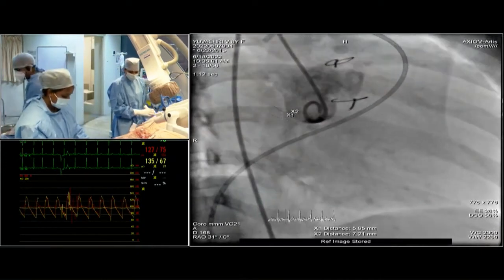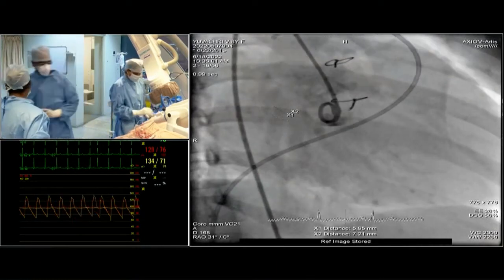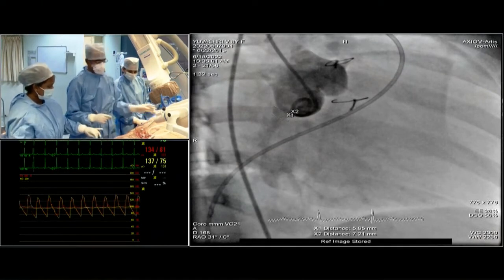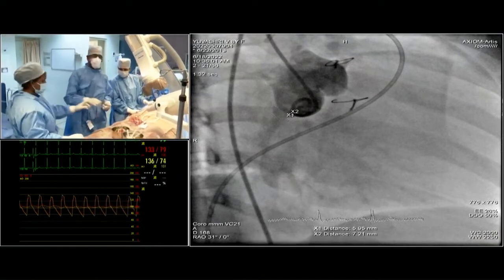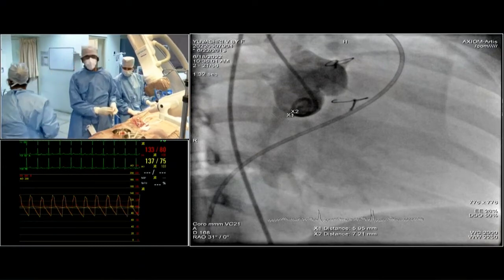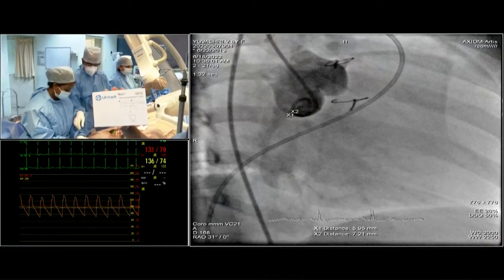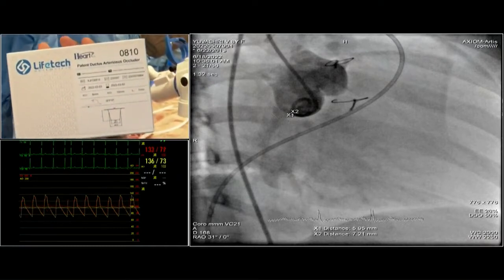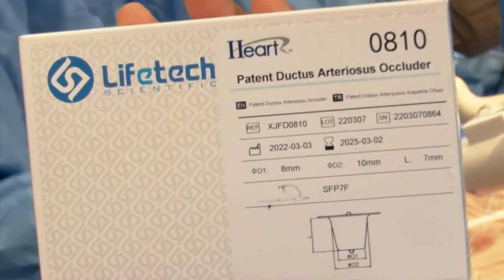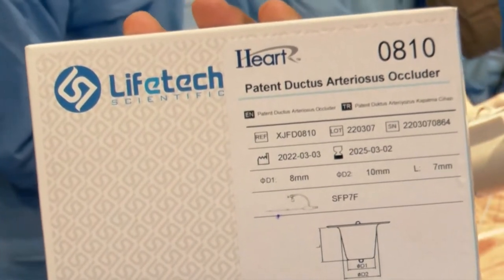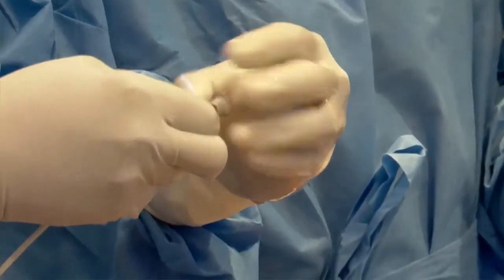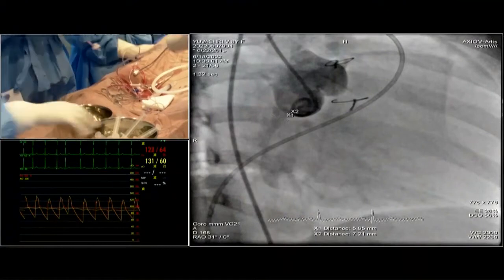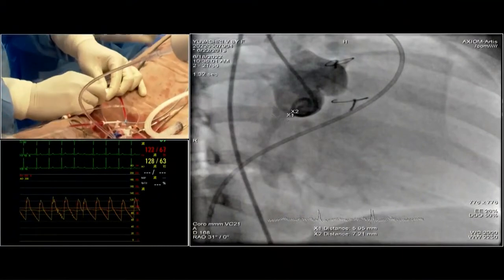Dr. Jai Ranganath's point is very valuable: the coronaries arise from the upper end of the sinotubular junction, whereas the ventriculo-aortic junction is the site of the RSOV. This is a 10-8 device with a 14-millimeter aortic retention skirt, 10 mm at the aortic end, and 8 mm at the pulmonary end. Now we are loading the device.